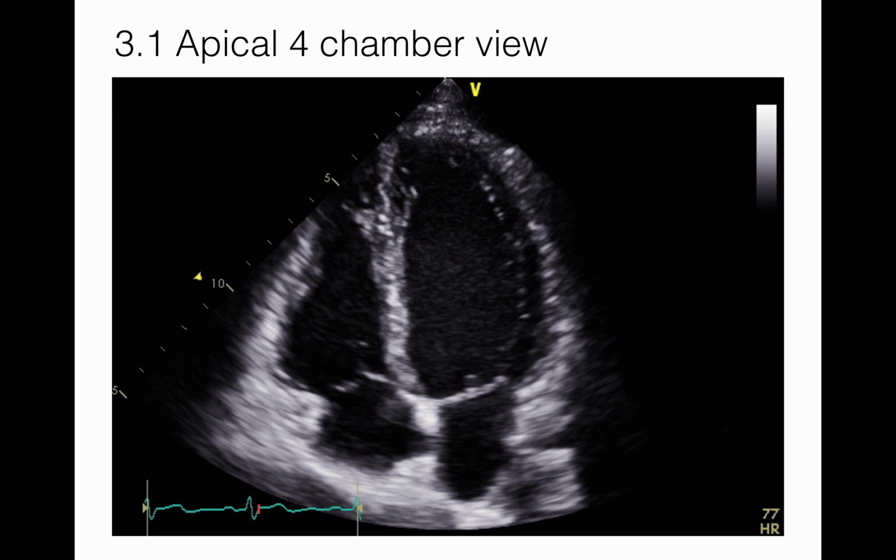Trabeculations in the right ventricle will appear more prominent than those in the left. The moderator band is a distinguishing normal feature of the right ventricle. It traverses the RV near its apex and contains conducting tissue. Normally, the insertion of the septal tricuspid valve leaflet is more apical than the insertion point of the anterior mitral valve leaflet.